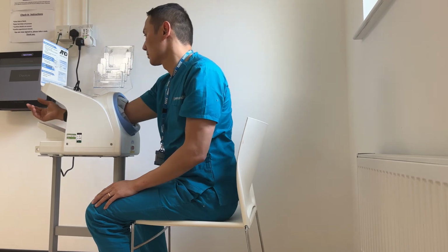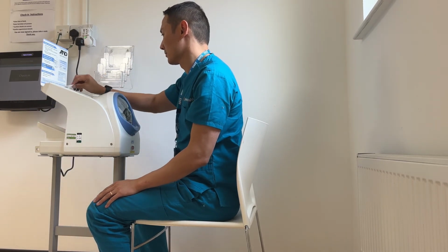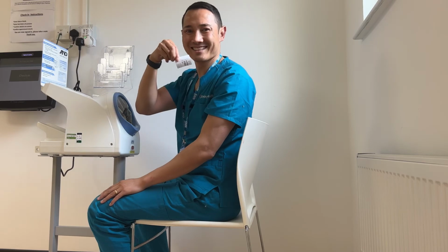General rule of thumb, blood pressure should be generally below 140 and 90. Your heart rate should be below 100, and you can repeat the blood pressure reading 2 more times and see if you can get a lower number. Try to wait a couple of minutes before each reading.